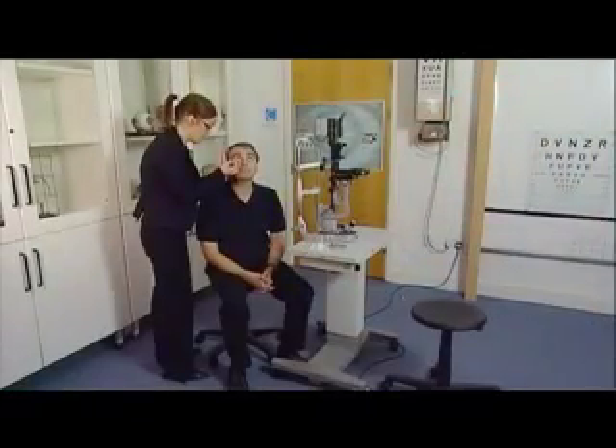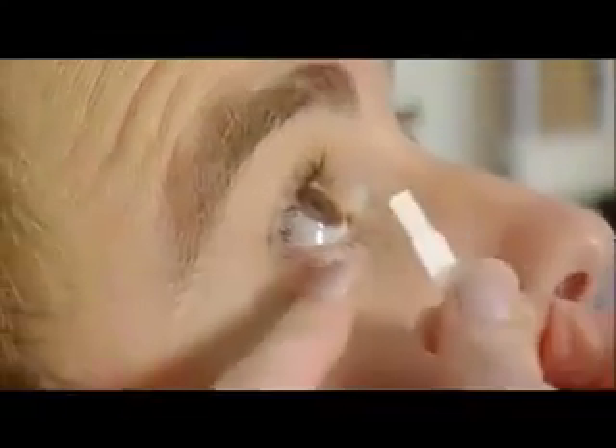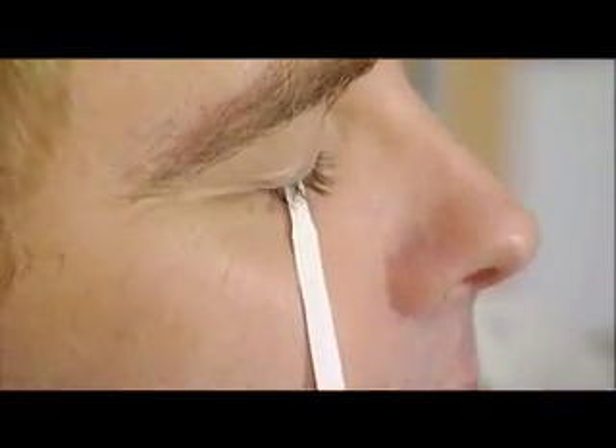A fluorescein-coated tier strip is placed over the lower lid margin at the junction of the middle and lateral third of the lid. The eye is closed and the strip is left in place for three minutes.